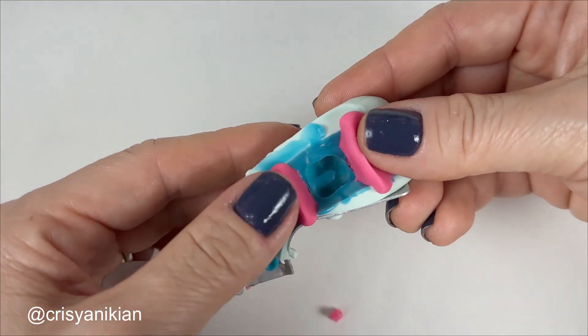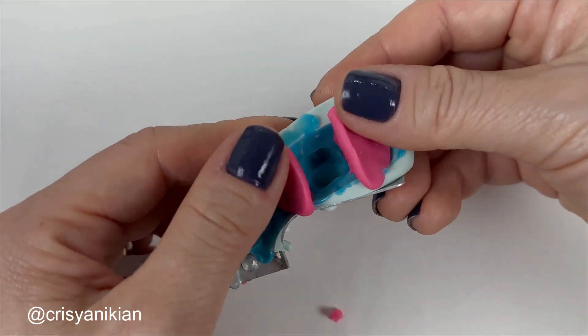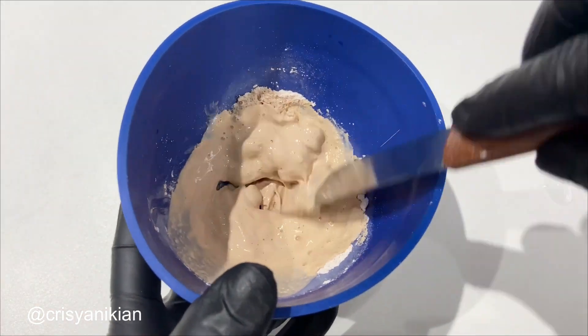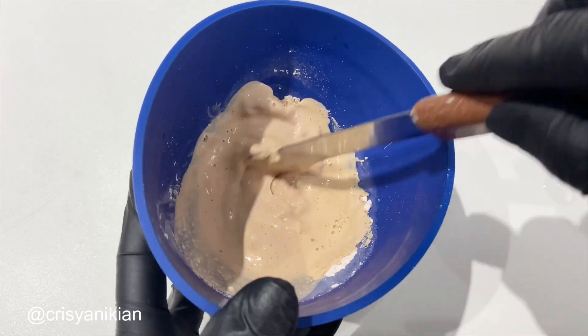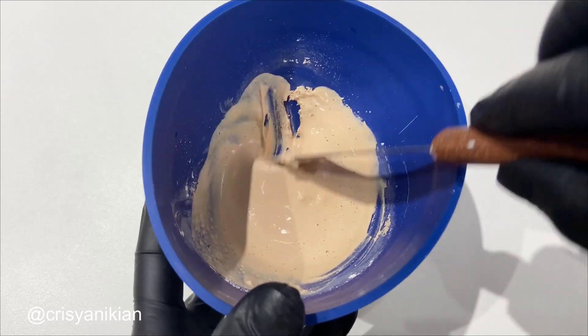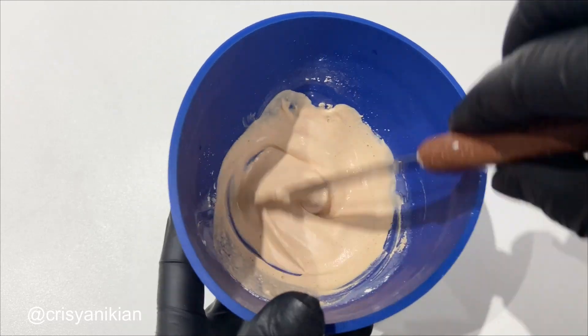Don't let the barriers sit too far apart — press them a bit to keep them close. Prepare special type 4 plaster to pour only over this tooth, using the proportions indicated by the manufacturer. For a single tooth, approximately 20 grams of plaster is enough.